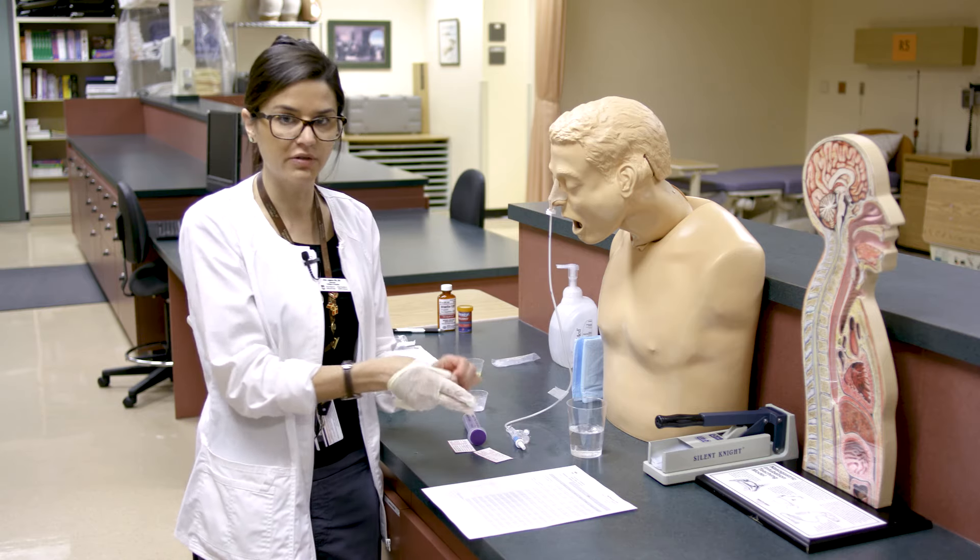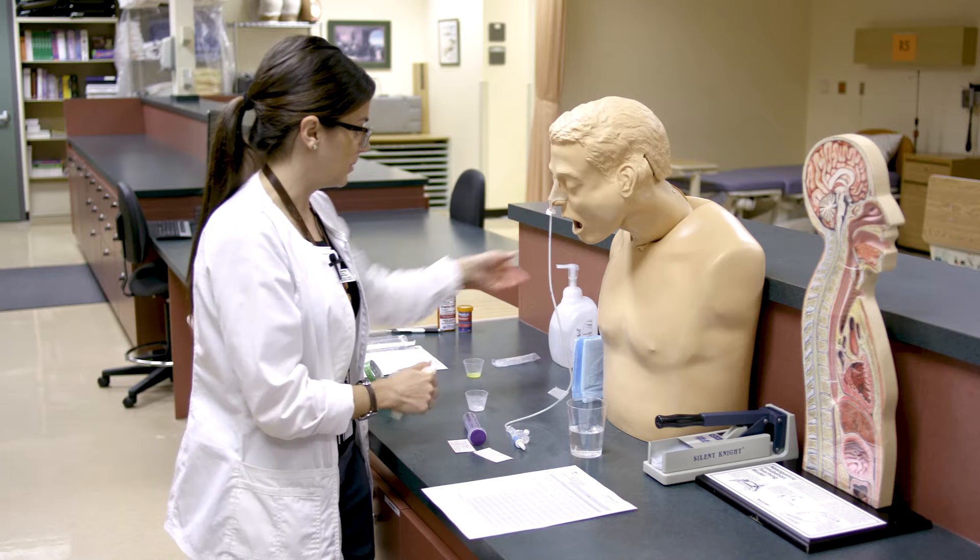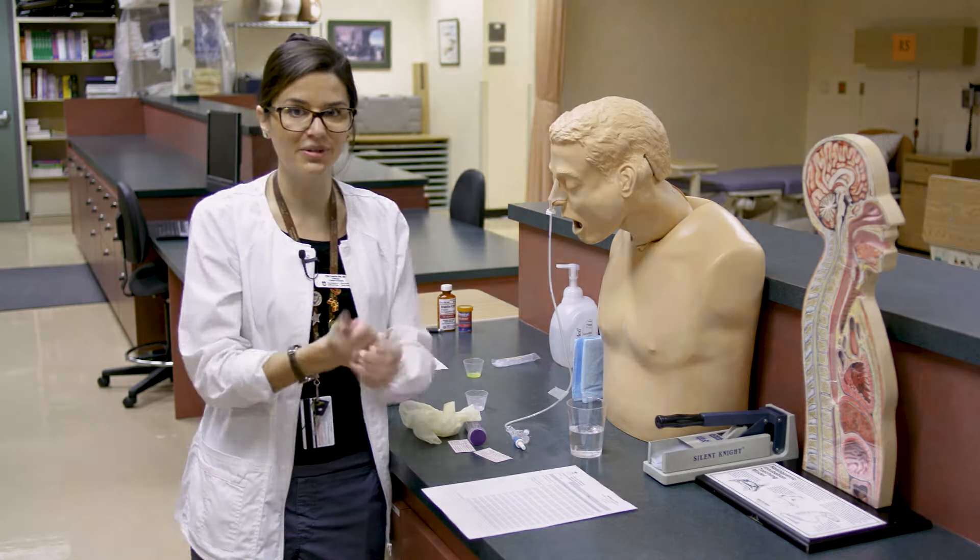Once all medication is instilled, flush the tube really well, then record on the ins and outs balance sheet how much fluid you gave for medications including flushes. That covers the basics of crushing meds and giving liquid meds into an NG tube. Document on the MAR and make sure your patient is doing okay.